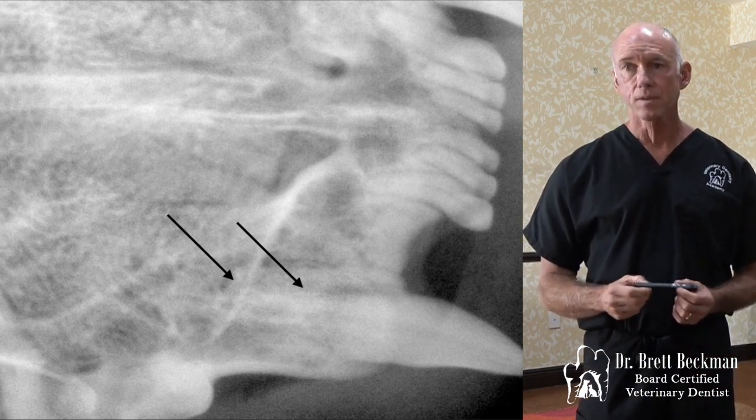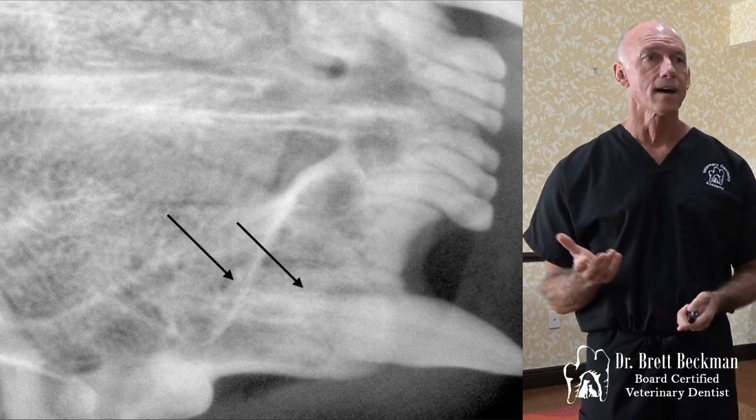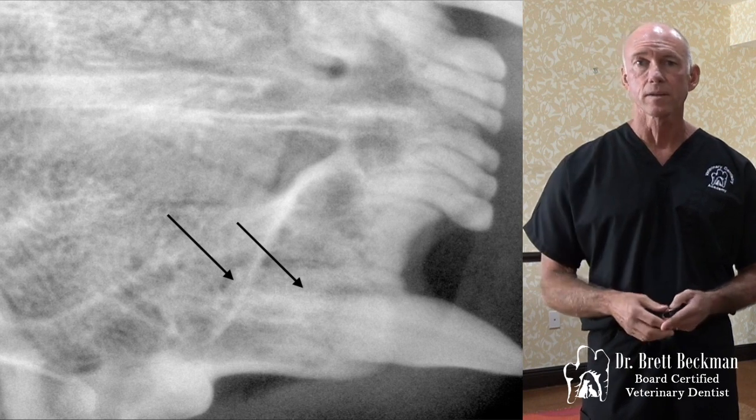But a lot of times, even though it looks like it's resorbed, like on those other two I just showed you, those you can get the whole thing out, and it's just as easy as doing a regular extraction.